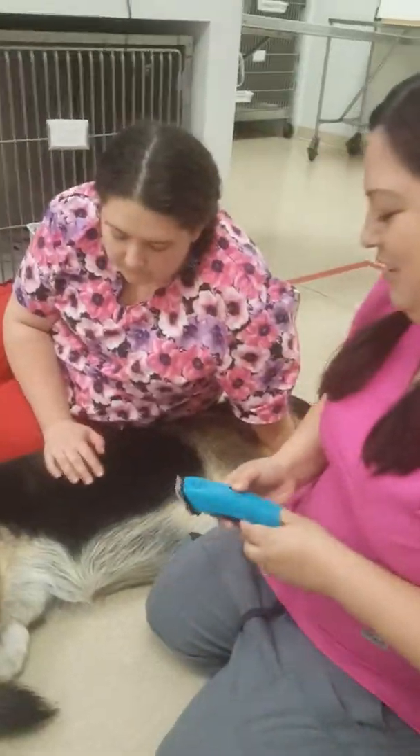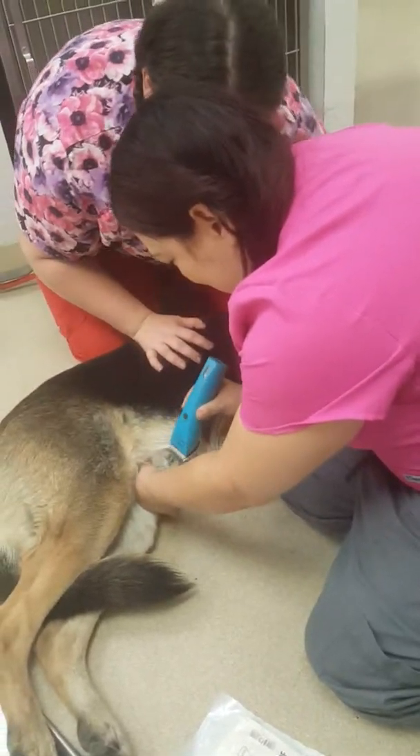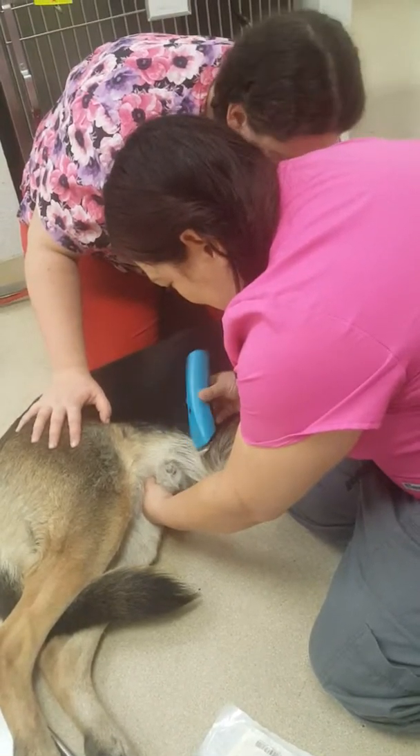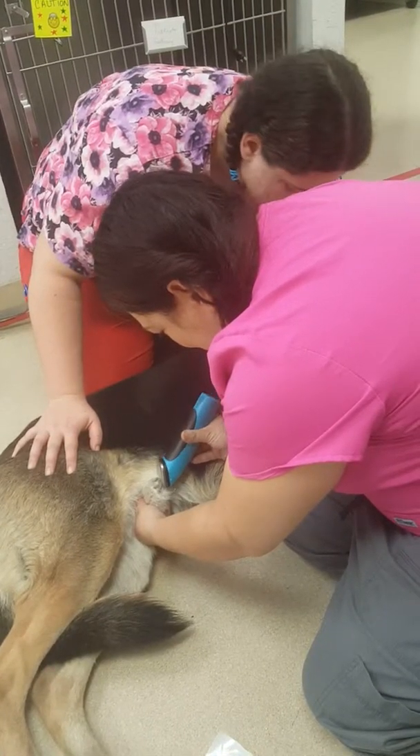One of the first things you want to do is shave the hair around the prepuce. Make sure you don't get any hair in your sample.